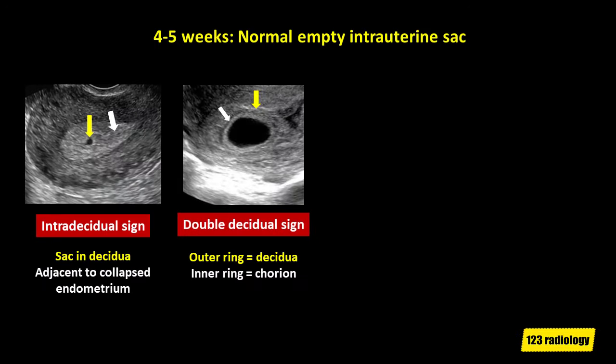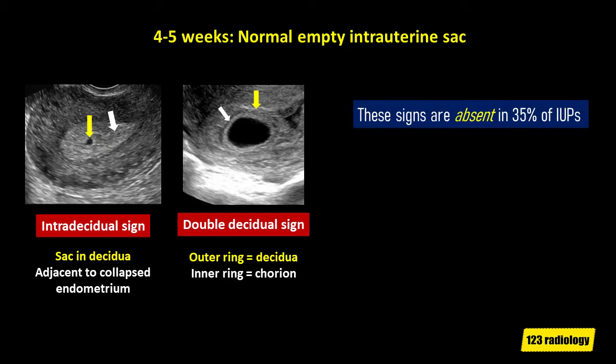If we don't have a yolk sac within a gestational sac, there are other signs that we can use to diagnose an IUP. At 4 to 5 weeks it is normal to have an empty intrauterine sac. The image on the left shows the intra-decidual sign — the yellow arrow shows a sac-like structure that is embedded eccentrically within one of the decidua, located adjacent to a collapsed endometrium. The image on the right shows the double-decidual sac sign: the yellow arrow shows the outer ring, which is the decidua, next to the inner ring, which is the chorion. Note that these signs are absent in 35% of intrauterine pregnancies, so keep that in mind.